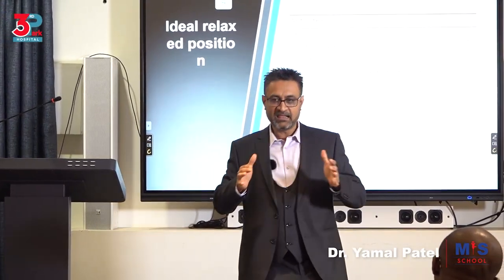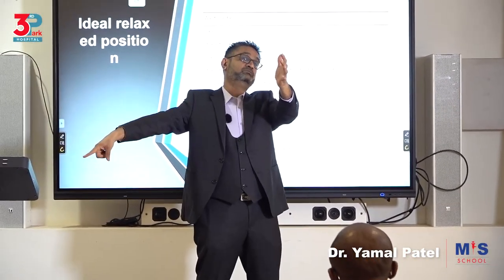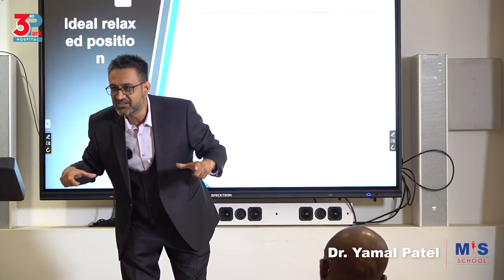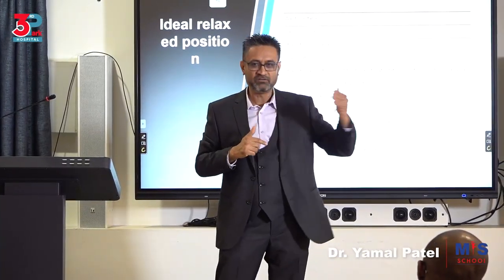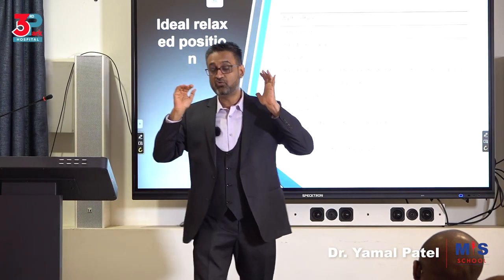You know why? That's the line where the screen is fitting your angle of view and you're seeing everything so nicely. When you're here, you're seeing this big. So if you want to see something here, you'll have to do this and do this and do this. You've understood? So when you're close, it's a problem. When you're too far, the screen is that much, you're seeing this person moving that phone of his and eating popcorn, and you've understood? So your view is capturing things that you don't want to see. You want to see the movie. So FGH disappears. So you have to think why. Why every time I come to book a movie theater, FGH is gone? You get it? That is because of that. It's soothing to your eye, and it's fitting your screen. It's not too close, it's not too far.